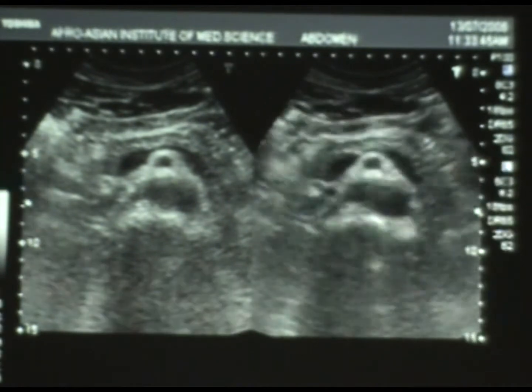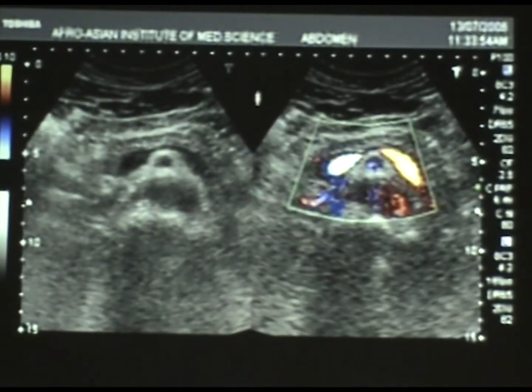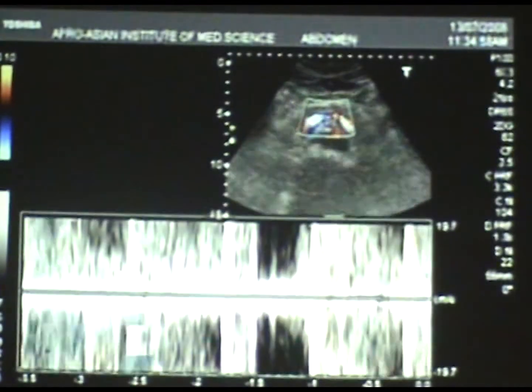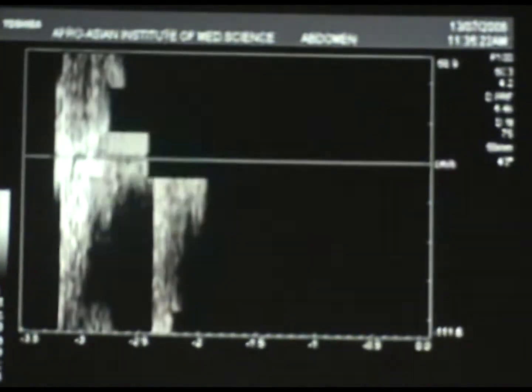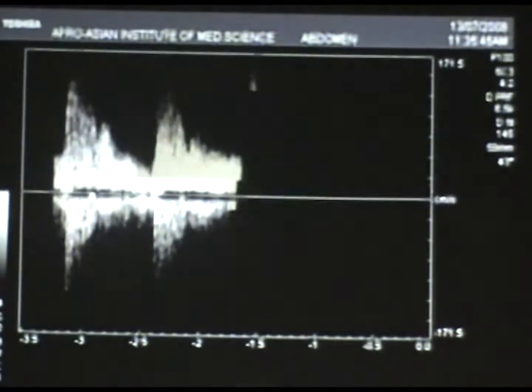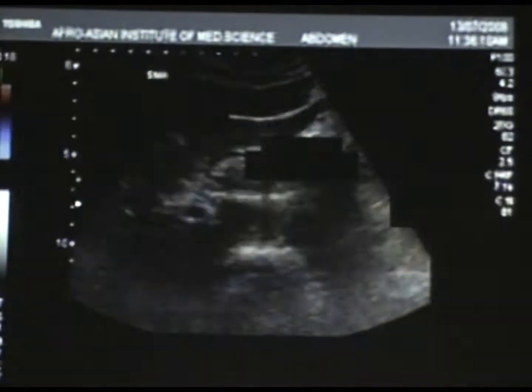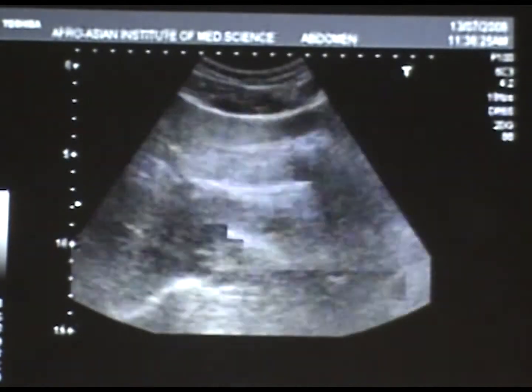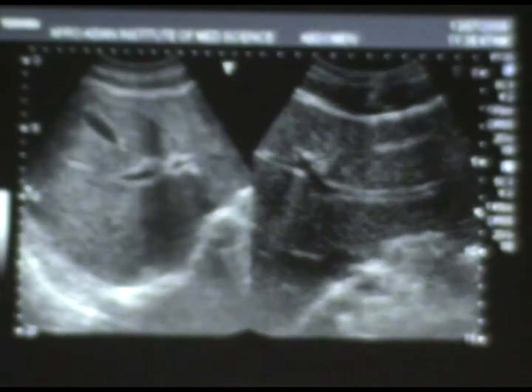Don't do it in that manner, finishing everything on grayscale and then putting the color Doppler, because color Doppler is part of your systemic examination. It is not something to be done separately. So if we need, we can assess superior mesenteric, celiac trunk and other things.